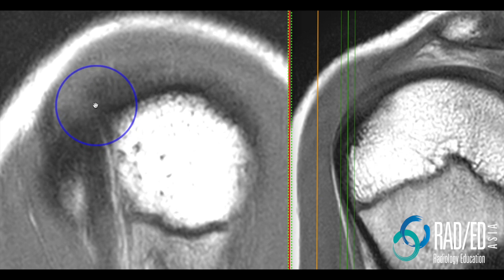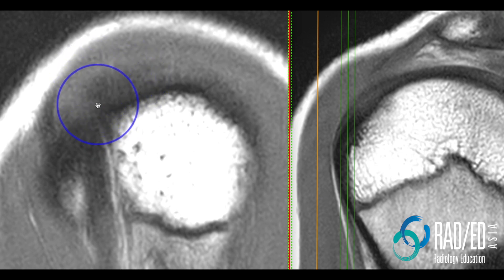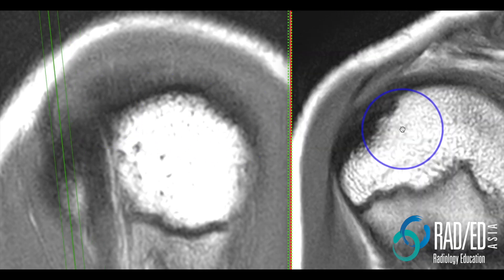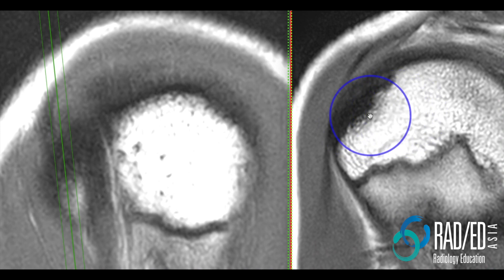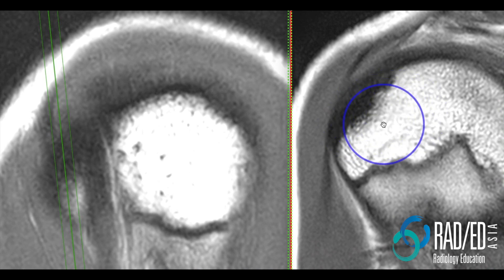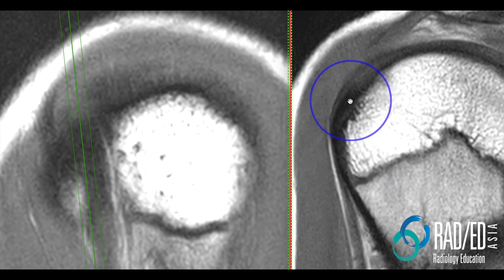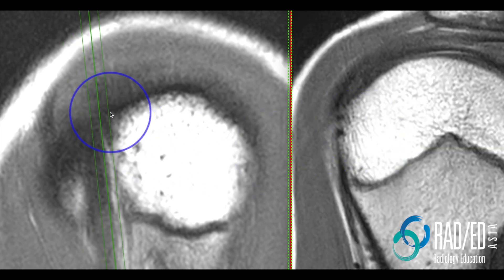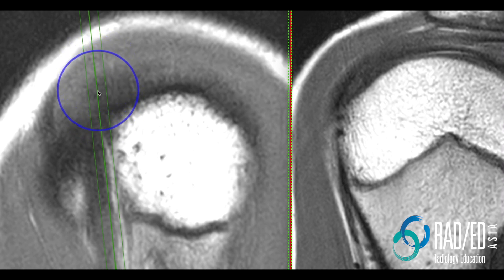Here's the bicipital groove. This is the supraspinatus tendon and these are the anterior most fibers. Now if we cross reference that, we are on this slice where anterior to the bicipital groove, we're now coming into the bicipital groove. We don't see biceps all that well — it's a bit partial volume — and if we go one back, we are now at that posterior margin. The slice is going through the anterior most fibers of supraspinatus, and here they are.